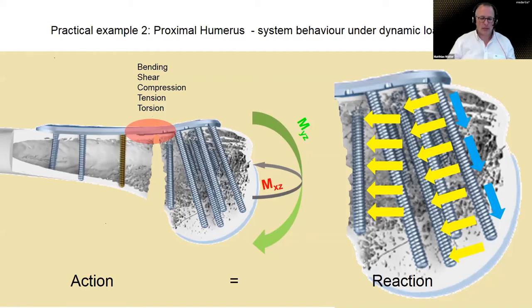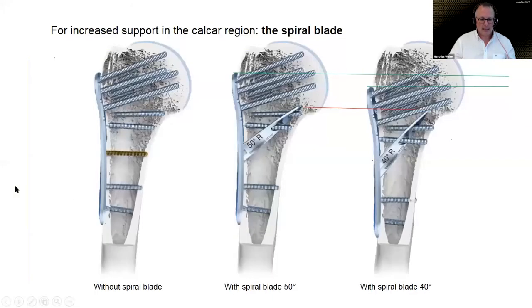So just talking about the stability of the actual implant as such, unnecessary knowledge, okay? What we need to know is what's happening now in the interface. What's the reaction now inside of the bone? Because at the end of the day, we want to treat patients, right? We are not here to check out the performance of metalwork. If this would be the case, I would build implant plates that are 20 millimeters in thickness, but that's nonsense, doesn't mean anything, okay? Right, next.